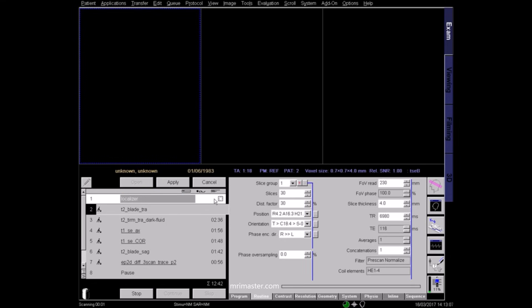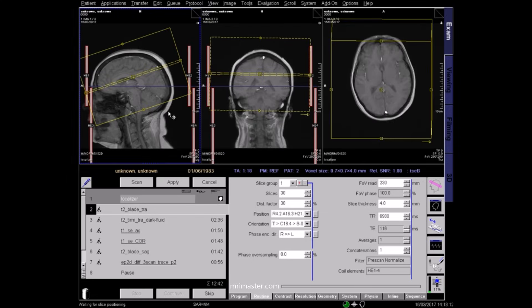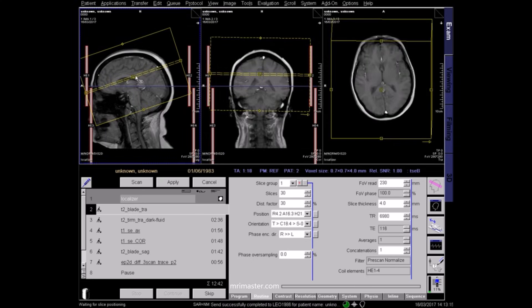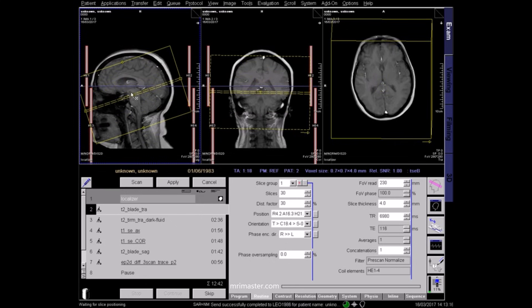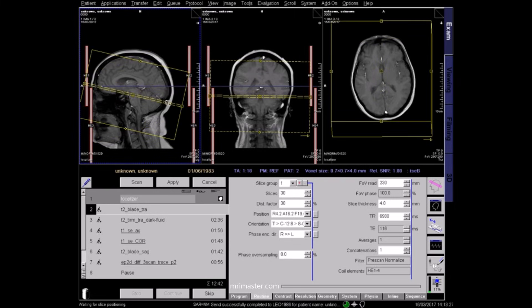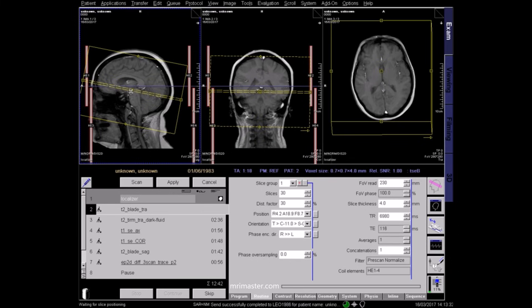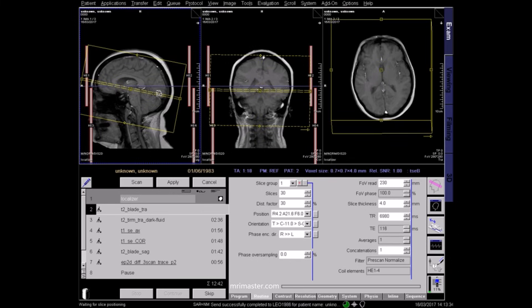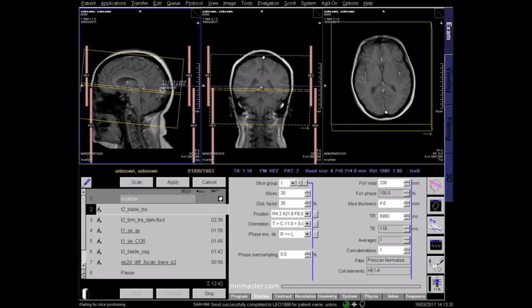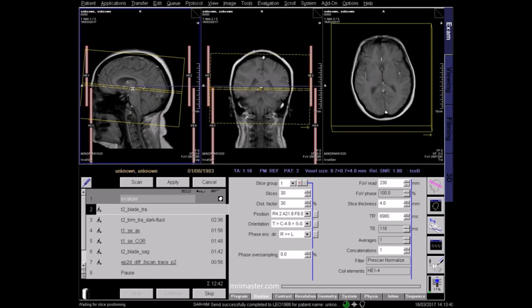Plan your axial sequence in all three planes. On the sagittal localizer, axial slices should pass parallel to a line joining the inferior border of the genu and the splenium of the corpus callosum. The slices should cover the brain from vertex to below the foramen magnum.